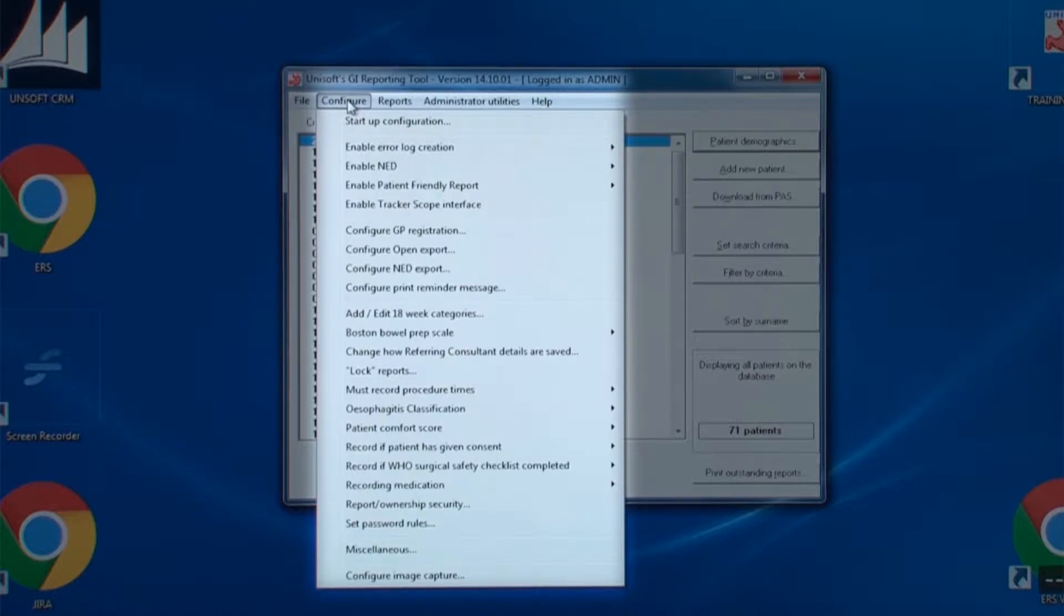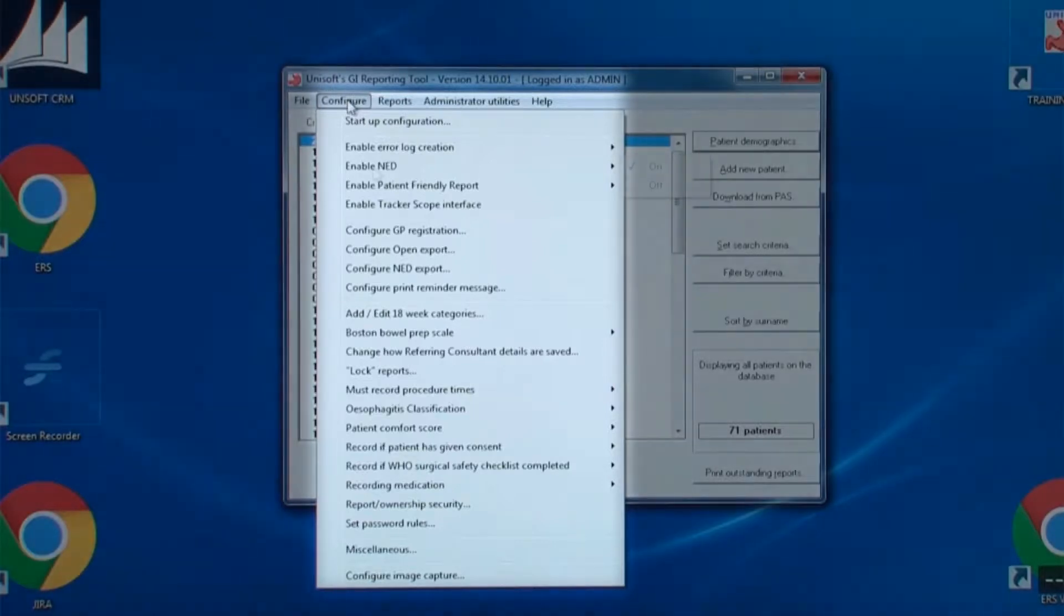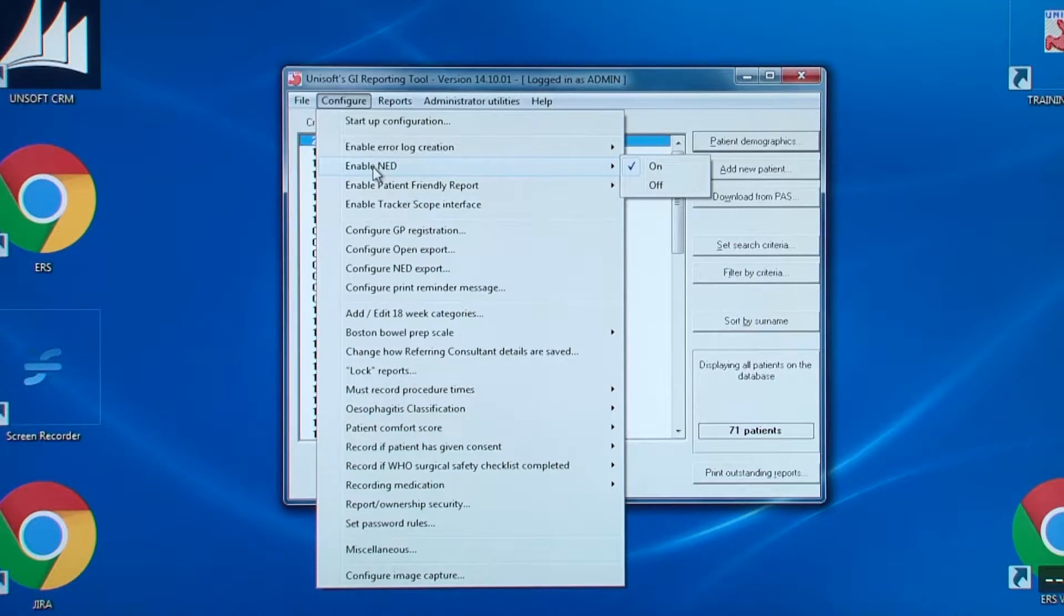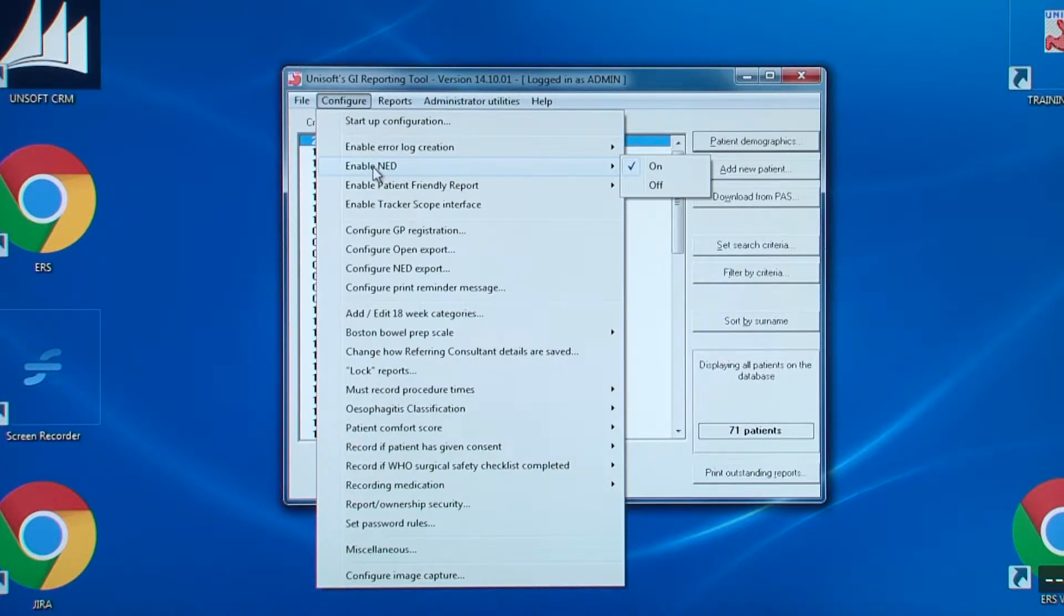You can see in the first two sections how different functions can be enabled and configured. Then there are a series of options that change how the software operates and which options need to be switched on. UNISOFT will have taken admin through these various options when the software was first installed.